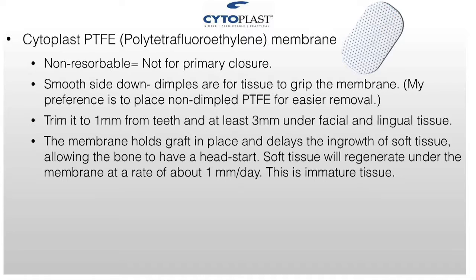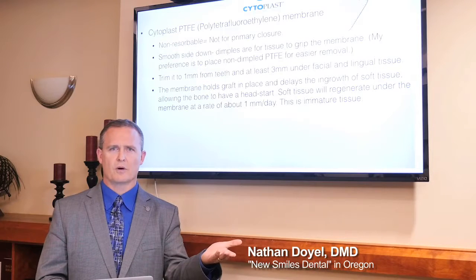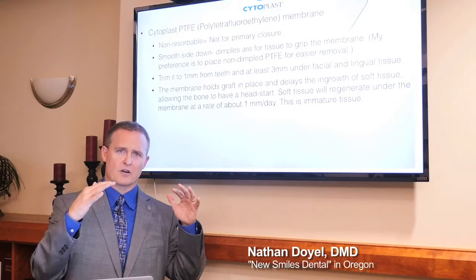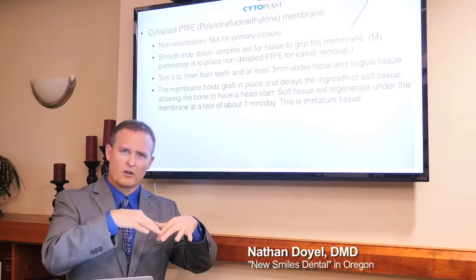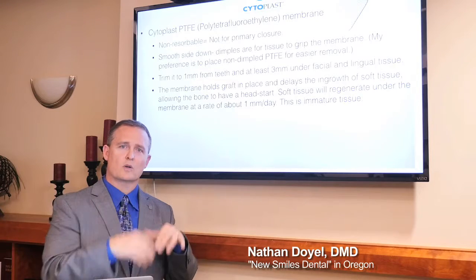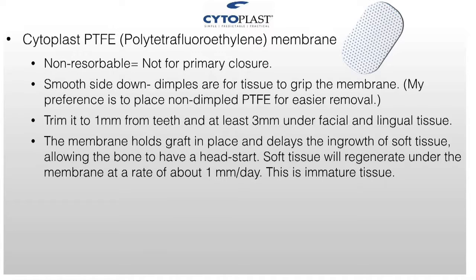Membranes hold the bone in place and keep the tissue from growing in there too fast. That allows the bone to get a head start. But when you remove this, what you'll find is that there's tissue grown completely over your bone once you remove it. What's happened is it's grown underneath there, but slower. It didn't just get to grow in there fast by not having the membrane there. It grew from the sides slowly. But that allowed the immature tissue, you'll see it's immature tissue. It doesn't look very good.